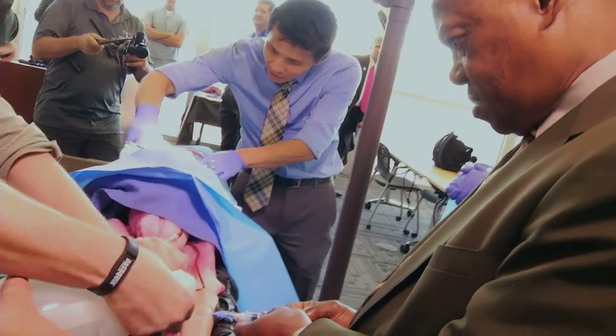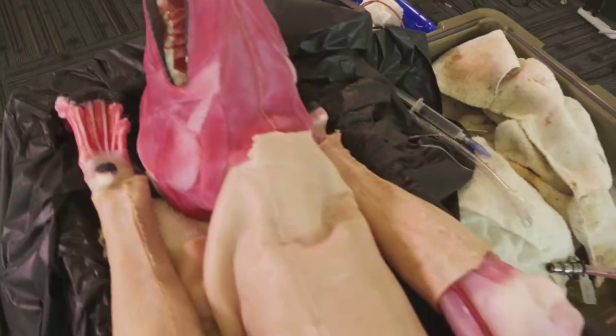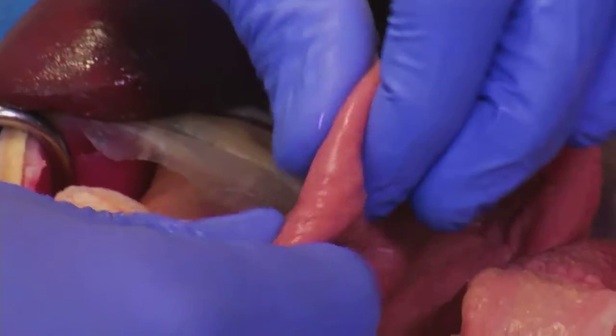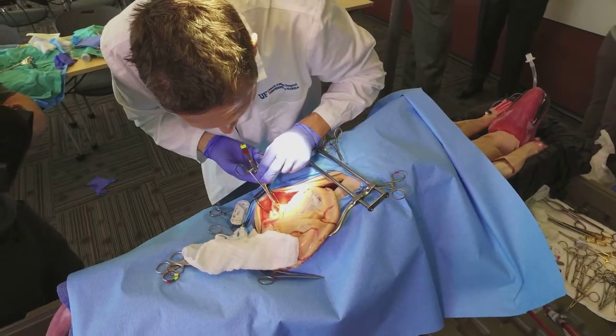I'm actually pretty blown away at the realism. Looking back on my education as a vet student going through the beginnings of surgery, the feel of the tissue was as real in this specimen as it was in a real animal. This is a good stepping stone to teach somebody the basics on how to ligate a vessel, how to remove a spleen, and then move into more specialized surgeries. I think this will be a good replacement.